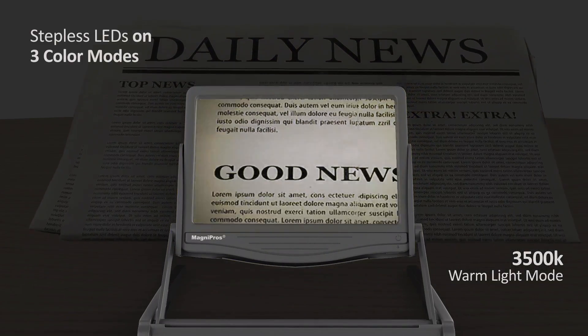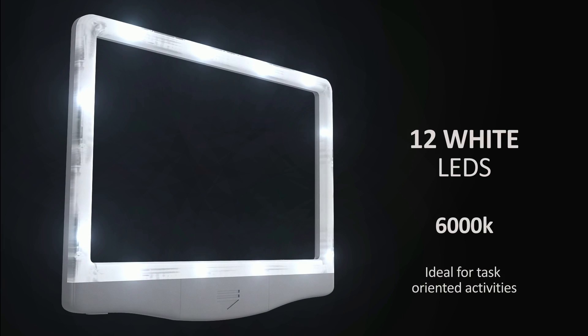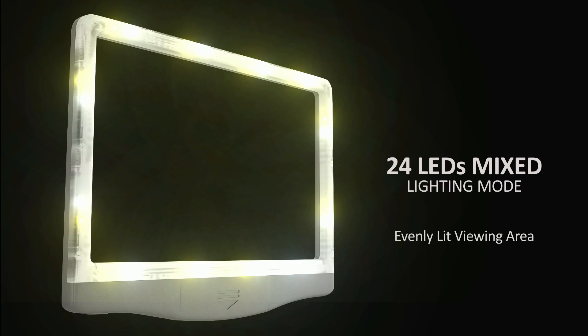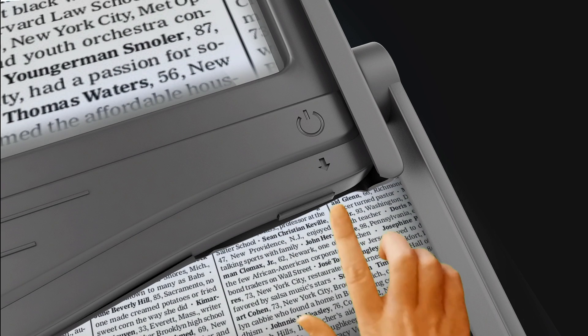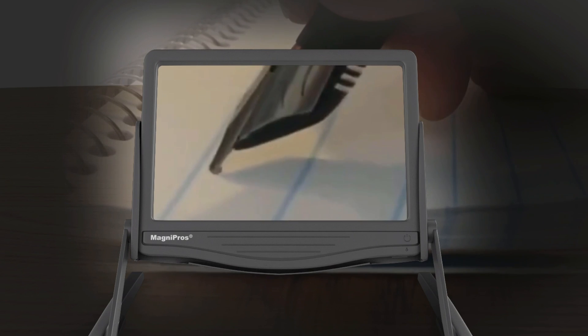This magnifier comes with 3 color light modes for your needs. You have different color modes to choose from — it comes in warm, cool, or just regular LED lighting. And it all can be controlled by just the touch of a push button.